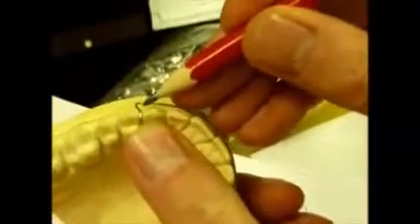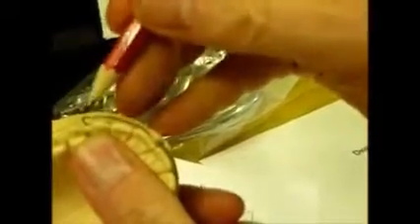out. Now, the most common failure here is this bend, where this isn't contoured over the contact point, and it comes out too far. So what do you think of this one here? I think this is really well done. I think this is a very nice piece of wire work.